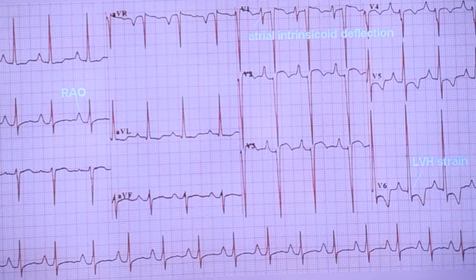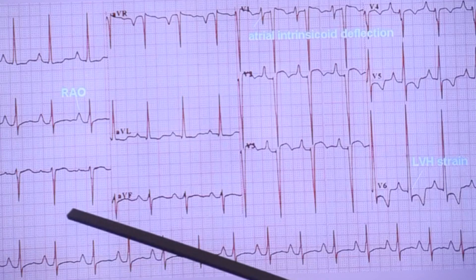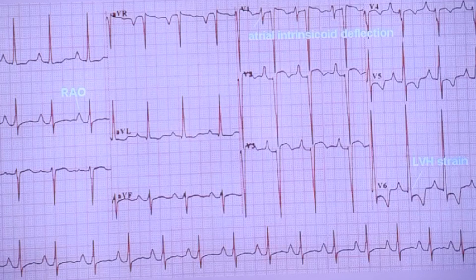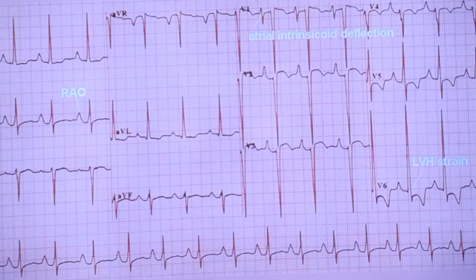So these are the features: leftward axis, right atrial overload, and left ventricular dominance in a cyanotic congenital heart disease would suggest tricuspid atresia.